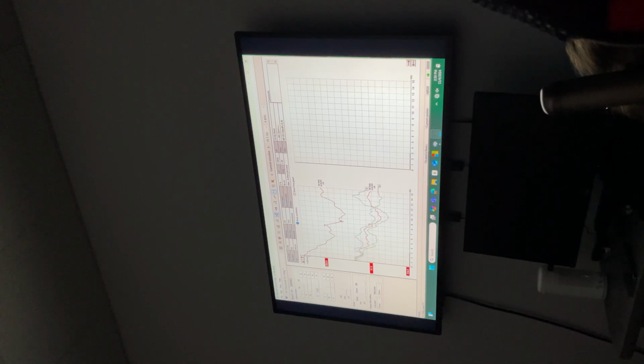Something is off with the normative data. Let's see what's the problem. Do you agree with my markings? Yeah. What about this? This is too early, right? Yeah. Or this could be fine. Let's see. It's a little early. So what is that then? Wave 3? I don't know.